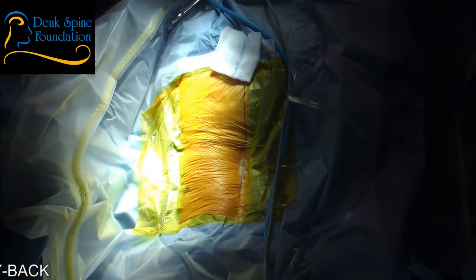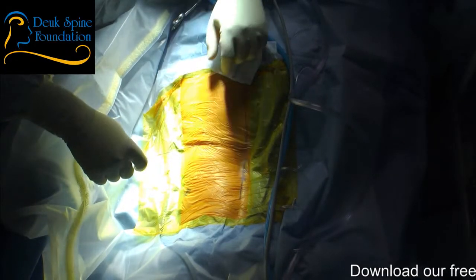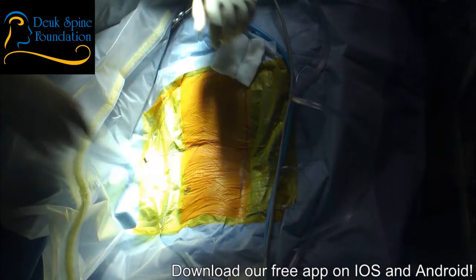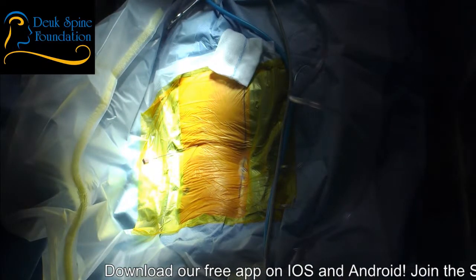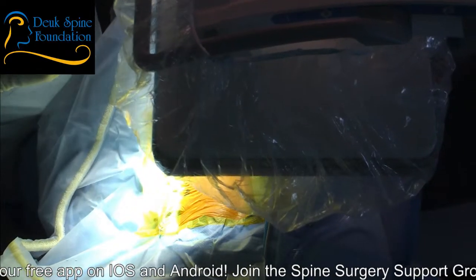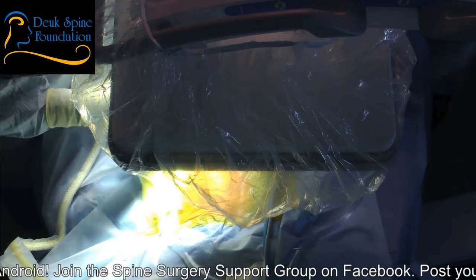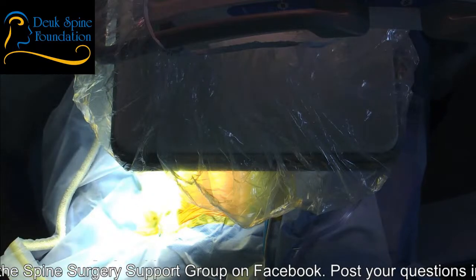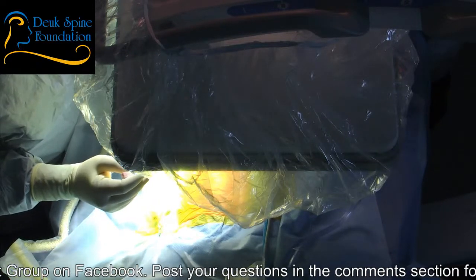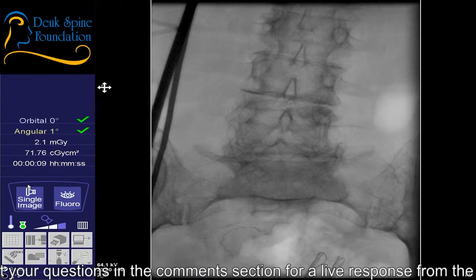This is not an easy level to do. On a scale of 1 to 10, this is as hard as it gets — this would be a 10. The reason for that is the fact that the bones are slipping at L5-S1, and L5-S1 is the hardest level to do anyway. So the slippage just makes it even harder. Let's see if we can do this. You can see the angle I need to come in at is very steep.